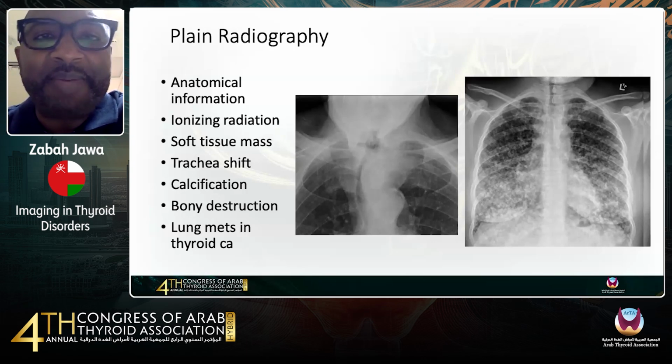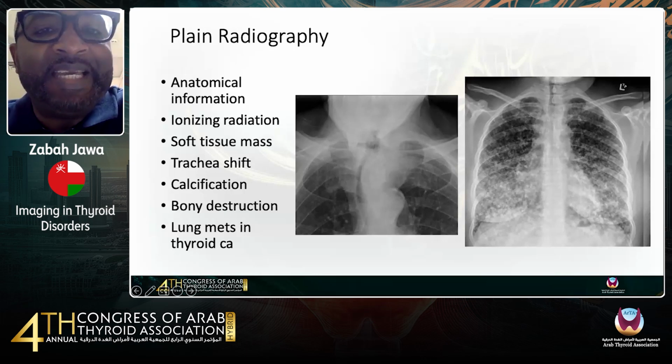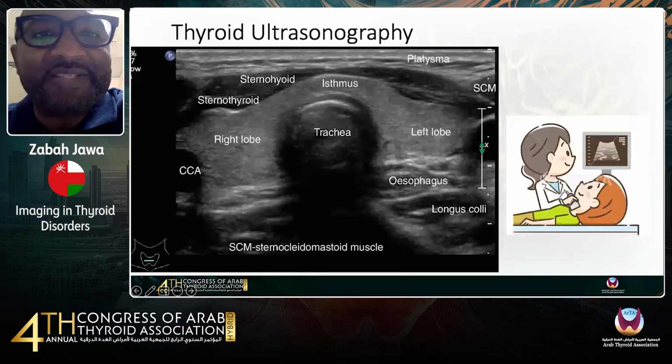So even though plain radiographs are no longer very useful in the initial assessment of thyroid disease, they find a good place, particularly when you're planning for surgery or when you're looking for metastasis in the chest.